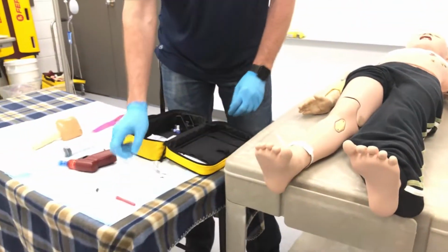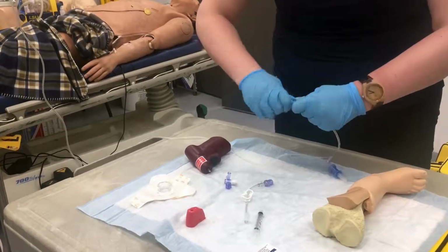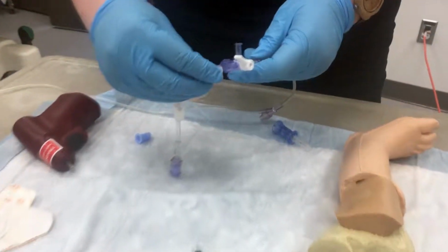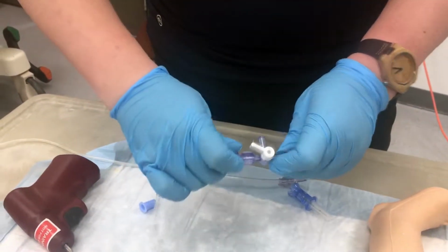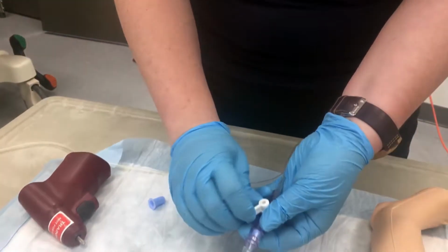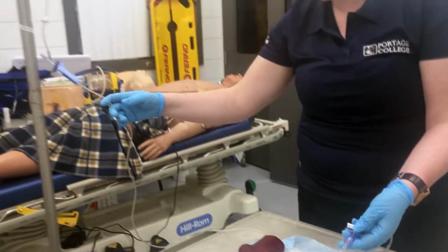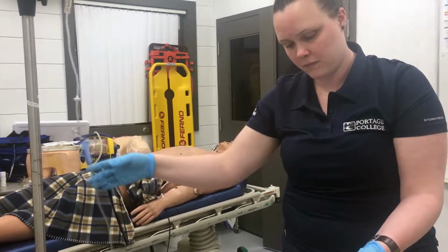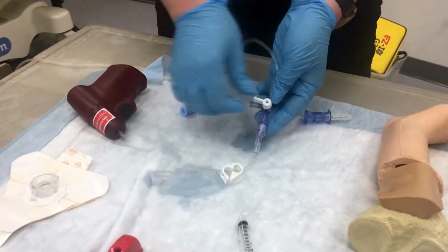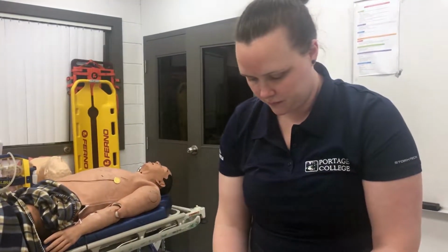Choose appropriate needle according to the patient age and size. Prepares supplies, prime connection, and IV line with stopcock. Attach needle set to EZ-IO power driver and remove safety cap from the catheter.